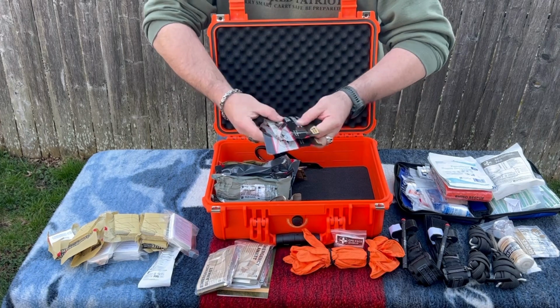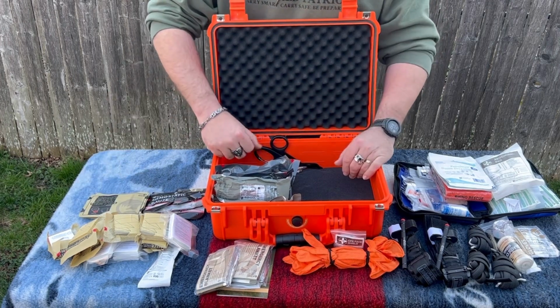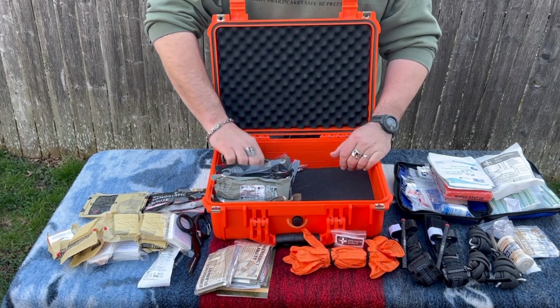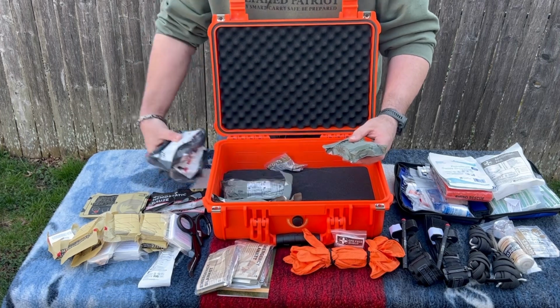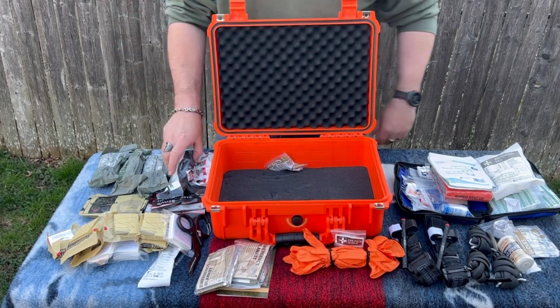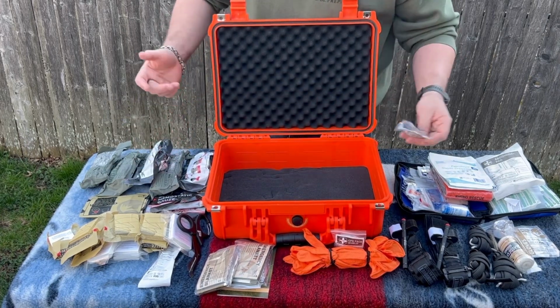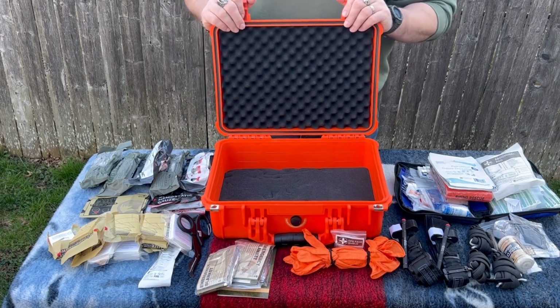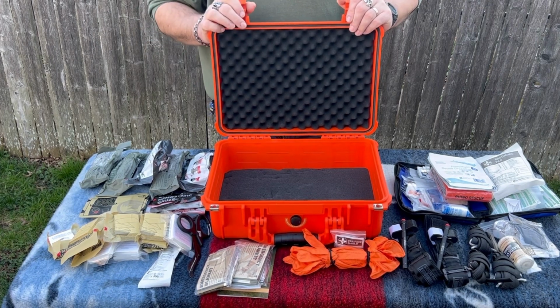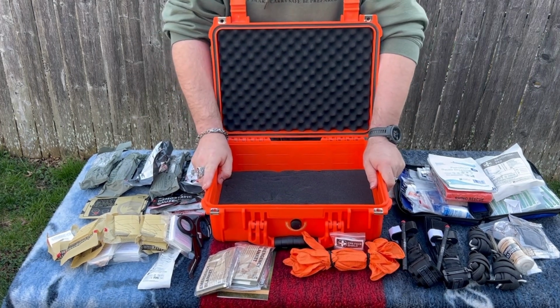There is hemostatic gauze that is in this kit. There are some chest seals for penetrative trauma to the chest, which can happen during an accident. A decent pair of rescue shears. And then also we have multiple Israeli bandages. Now, Israeli bandages kind of get some hate, and I've got the 4-inch variety and the 6-inch variety. But the reality is it's a compression bandage, and that's really all that matters. It is there to put compression on an injury, and the idea is that it helps you stop blood flow. So it's a pretty balanced kit for everything that I think he would need.